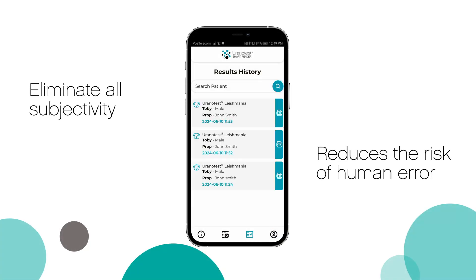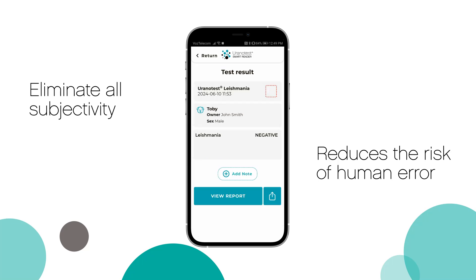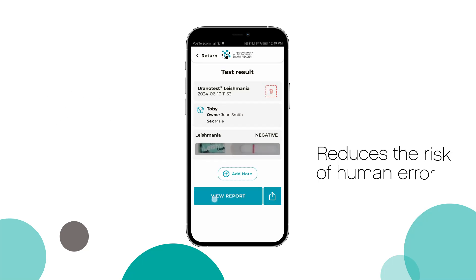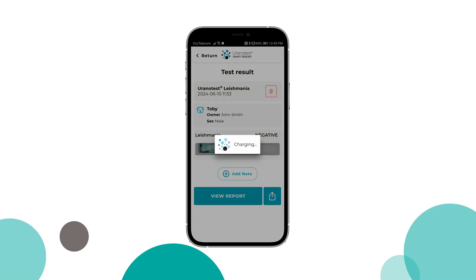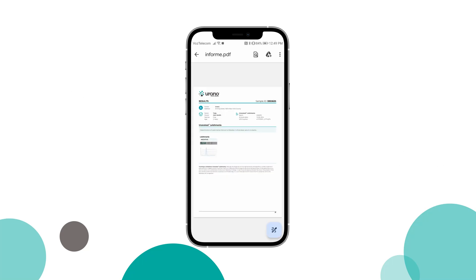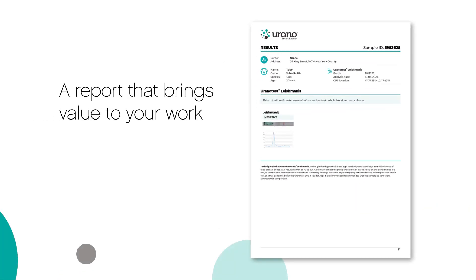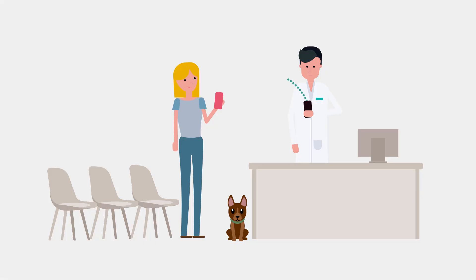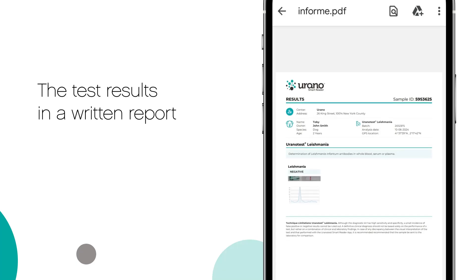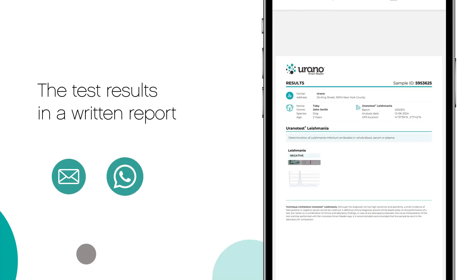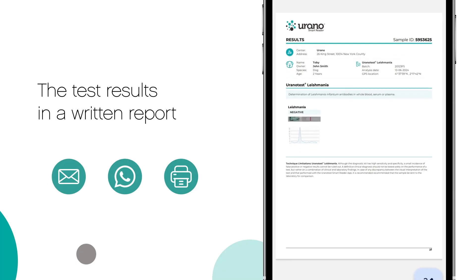The reports generated by the app can be found immediately in the results section — a report that brings value to your work. You can share the reports with your customers by email, WhatsApp, or print them for them.